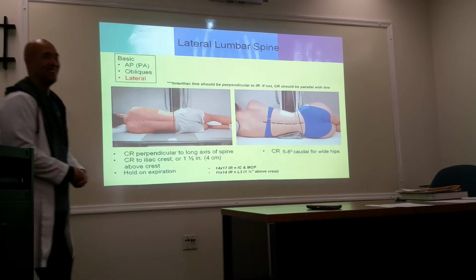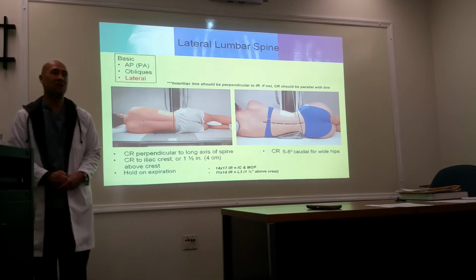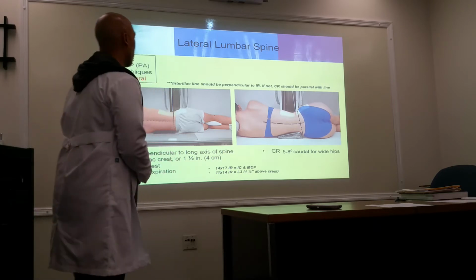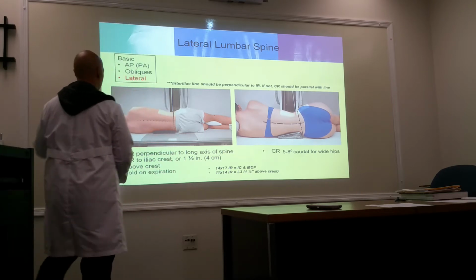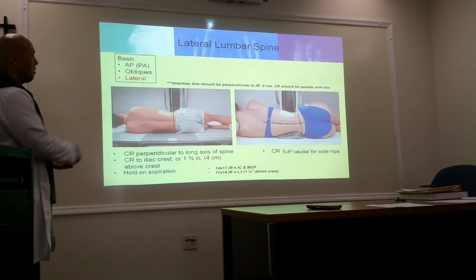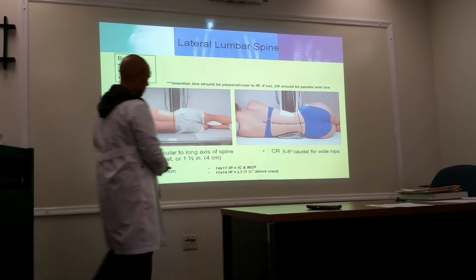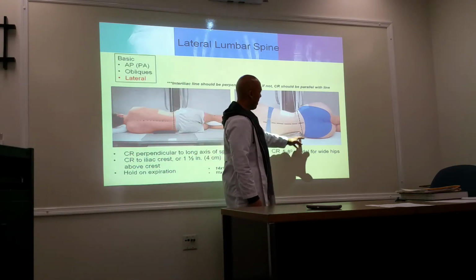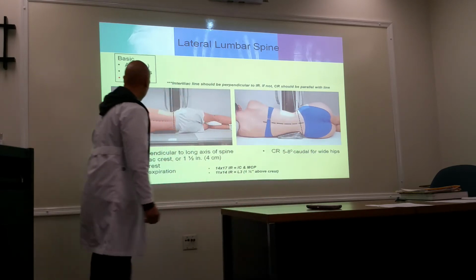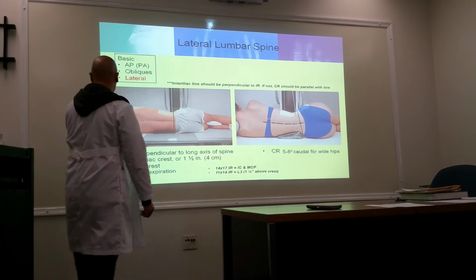It says mid-coronal plane. Mid-coronal MCP. Okay, so central ray at the level of the iliac crest and mid-coronal plane. All right. So if you're unable to get the spine straight, you want at least the central ray to match the inter-iliac line. It has to match. Okay?